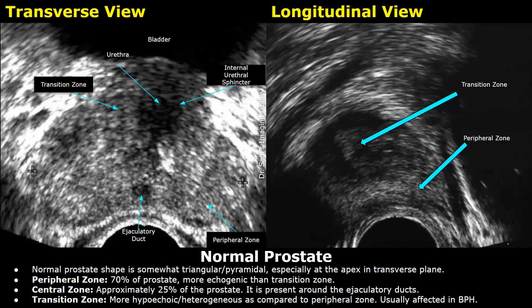On a transrectal view or TRUS image, the prostate is divided into zones. There are three main zones: the peripheral zone constitutes 70% of the prostate, while the central zone makes up approximately 25% and surrounds the ejaculatory ducts. The transition zone is only 5 to 10% of the prostate gland, but this zone is usually affected in BPH.